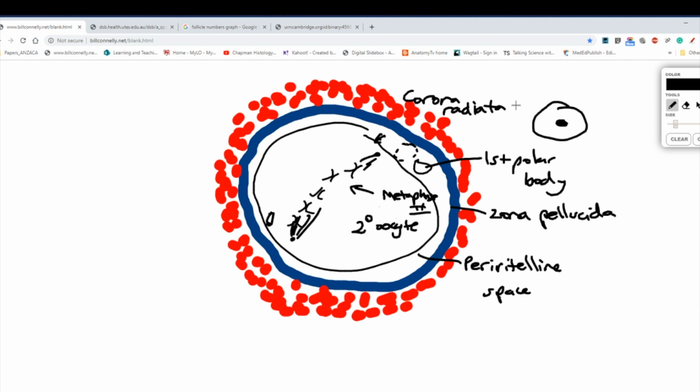Follicles are the structure that houses the oocytes. That's correct. So that terminology becomes really tricky. I know a lot of students, when I'm marking exam questions, talk about the secondary follicle being ovulated and picked up by the fimbria of the uterine tube, but of course it's the secondary oocyte which is ovulated. What ruptures is the Graafian follicle, the pre-ovulatory follicle, that then becomes the corpus luteum.